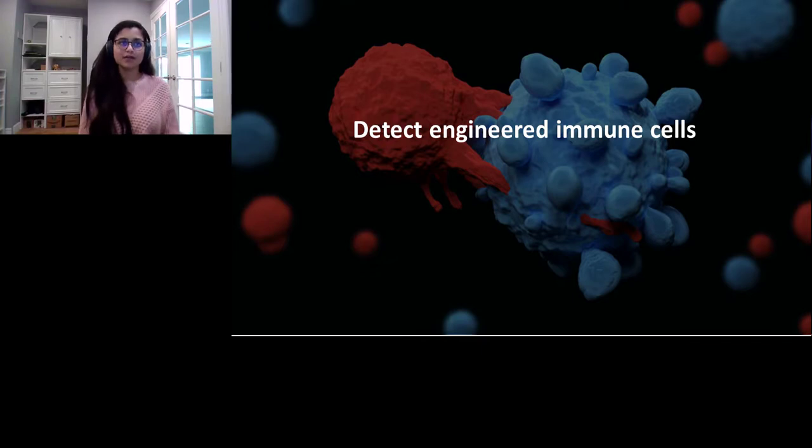And they wanted to use RNAscope to study the efficacy and the safety of these CAR T cells. By designing a specific probe against the 3' UTR of the CAR vector, they were able to visualize these CAR T cells within the animal model. Similarly, they designed RNAscope probes for Granzyme B to visualize the engagement of these CAR T cells.